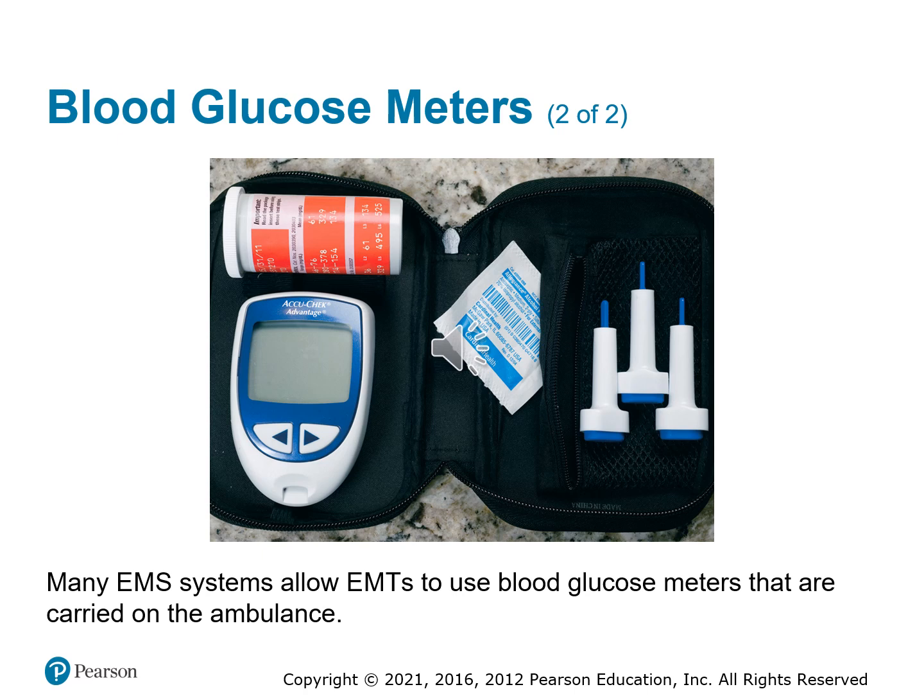One recommendation I would say is avoid where the patient would touch, because that's going to be the most sensitive area. Get over on the side of the finger, or a lot of people are doing it on the palm of the hand. Just any place you can squeeze out a few drops of blood to put in that machine.